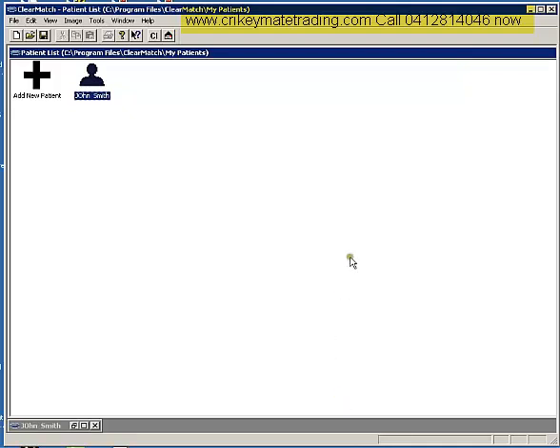I want to introduce you to the perfect solution to remove all randomness and errors in shade matching between you and your lab. It's called Clearmatch. It's developed in the United States and it's got a very large following over there.